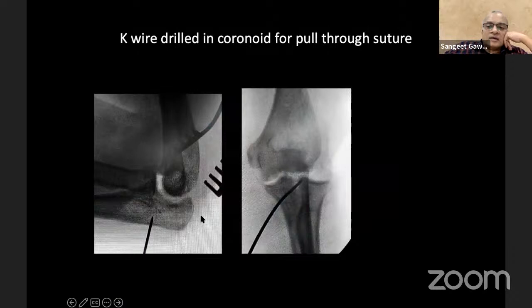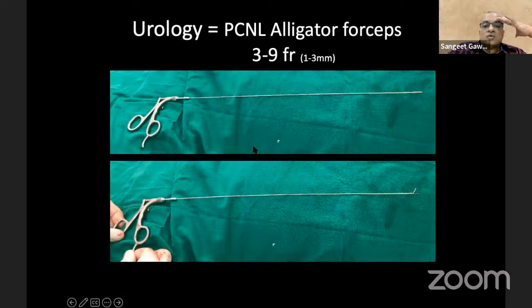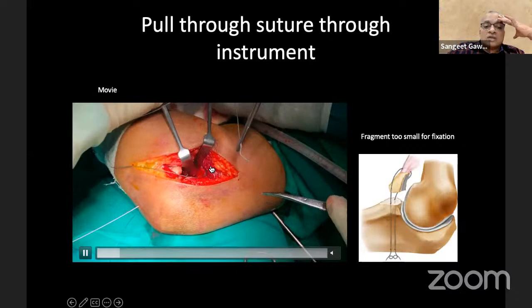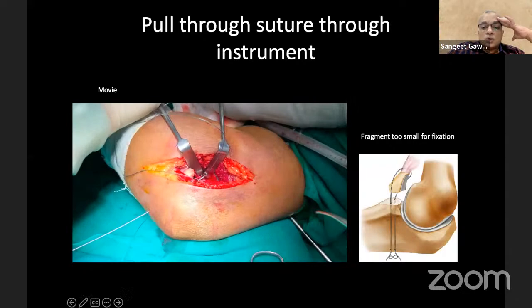Okay. So here what was done is, since we cannot reconstruct the coronoid, we take a pull-through suture. That is, drill a K-wire and then introduce a needle or any instrument. I use an alligator forceps, which is less than 2 millimeters. And you can see here, I have taken a suture on the anterior capsule, and one end of the Ethibond I am feeding to this forceps, or you can use a needle or any instrument by which you can pull through on the posterior surface of the olecranon.